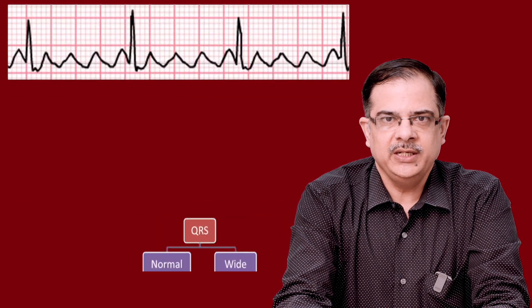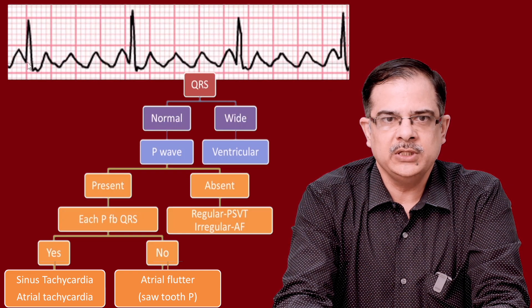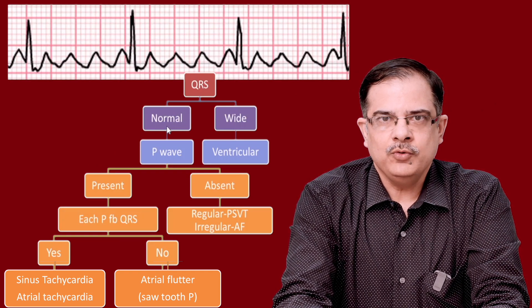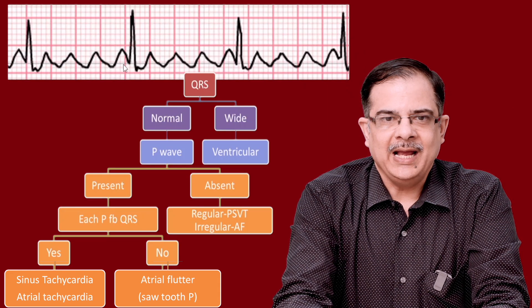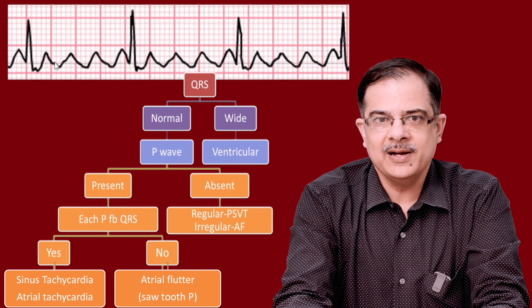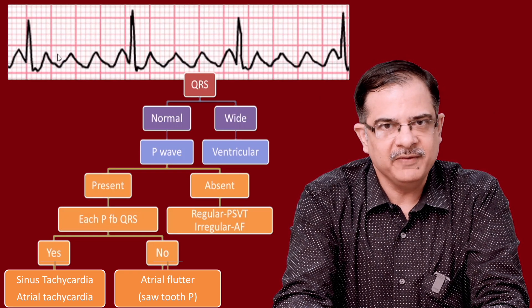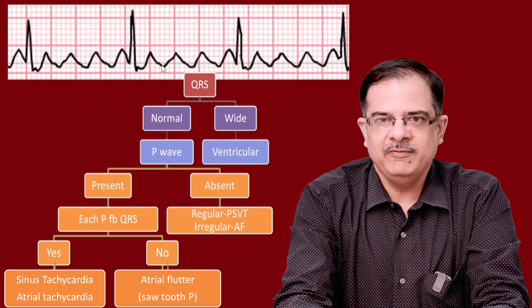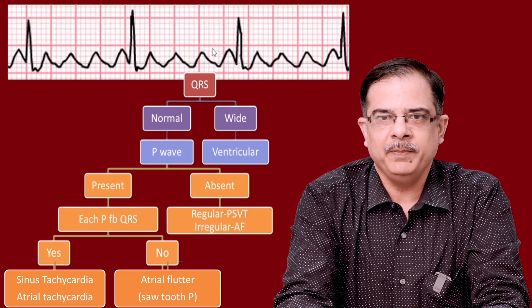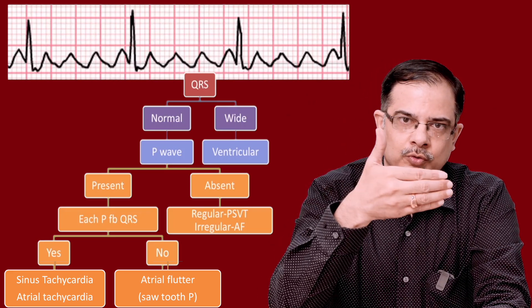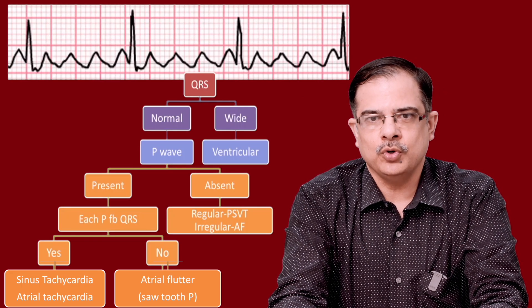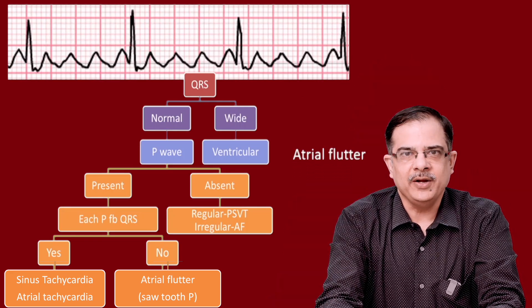Next ECG: QRS complex is normal in width. P waves are present. Is each P followed by QRS? No — each P is not followed by QRS, because the atrial rate is very fast and not all atrial impulses conduct to the ventricle — there is a fixed AV block occurring. The P wave pattern shows a sawtooth appearance, typical of atrial flutter. Therefore the diagnosis is atrial flutter.